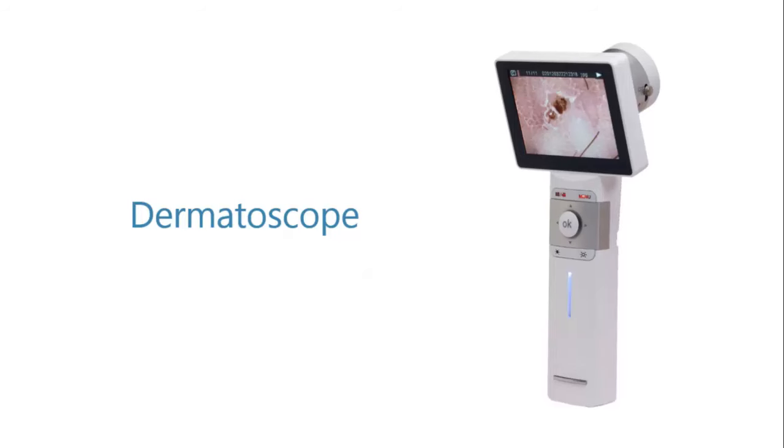The dermatoscope captures imaging of the epidermis and dermis of the skin. Please note that this lens needs to be in close proximity to the surface in order to display a clear image.